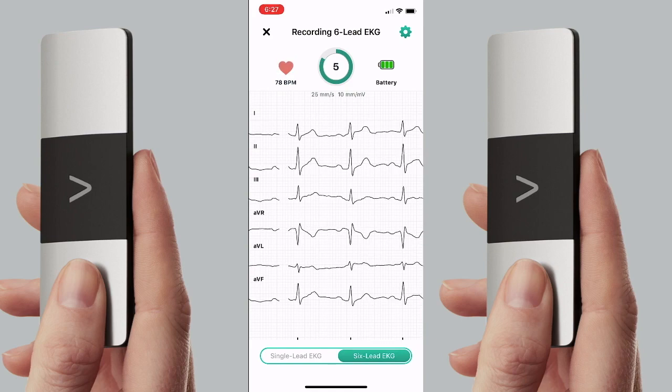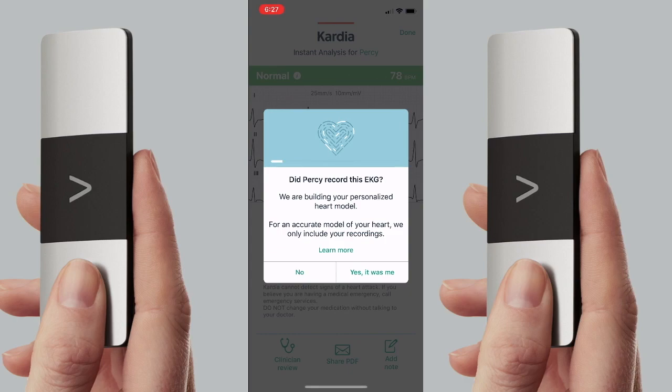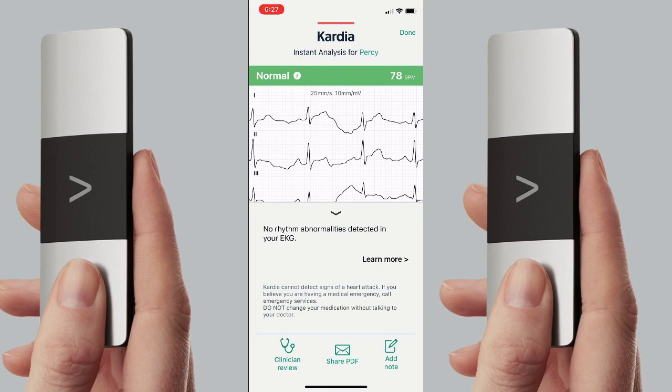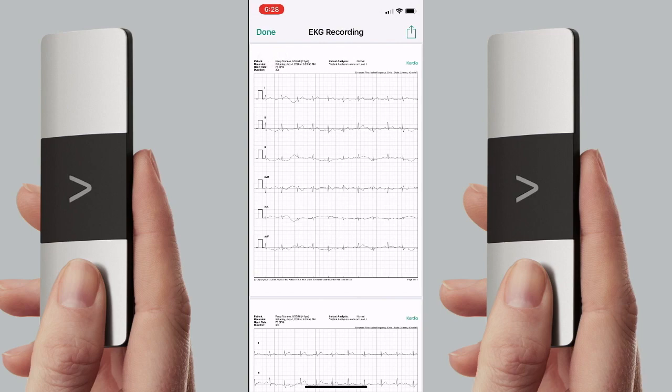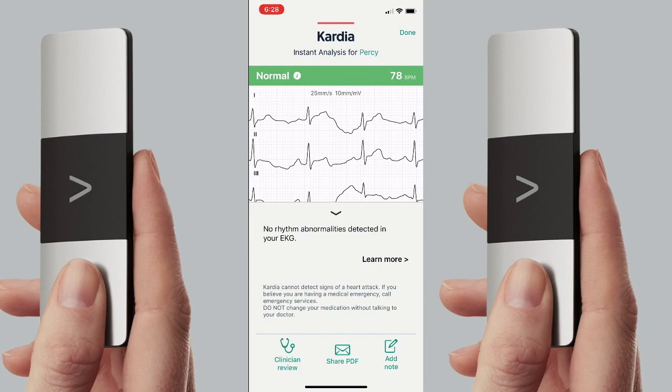In general, this six-lead device is very impressive — the quality of the tracing is so good. Even if the machine is unable to tell you exactly what is going on, your doctor should be able to know what is happening. It asked if I recorded this EKG — yes, it was me — and my current tracing came back as normal. It also has great features: it allows a clinician review, where a cardiologist contracted by Cardia can review the EKG. More importantly, you can share it as a PDF, which you can save — it's a nice, beautiful tracing — or you can email it or upload it to a patient portal at your doctor's office. Overall, this is a very impressive device and I've been very impressed with the ability to use it myself.